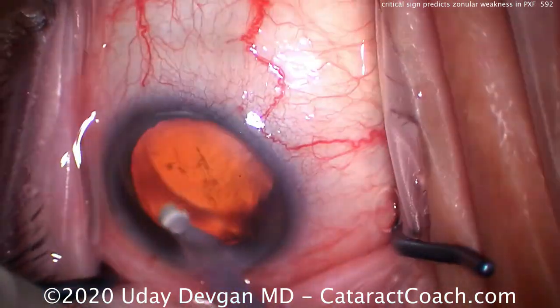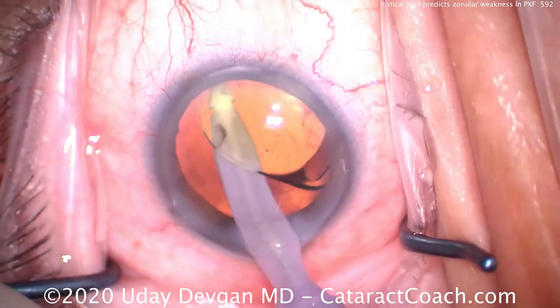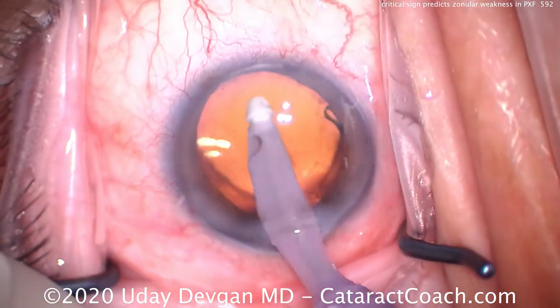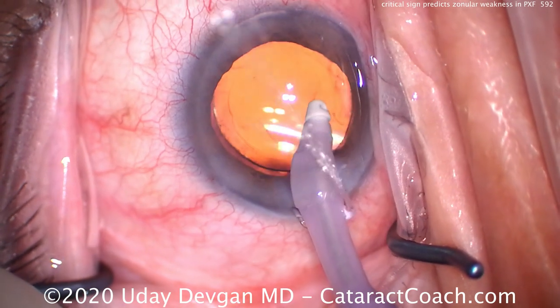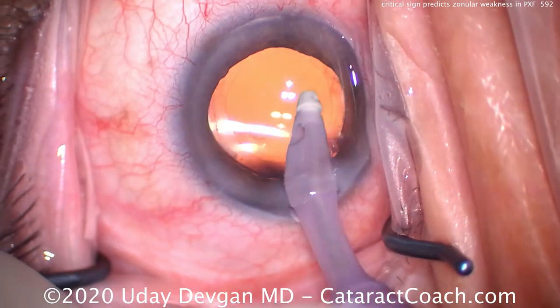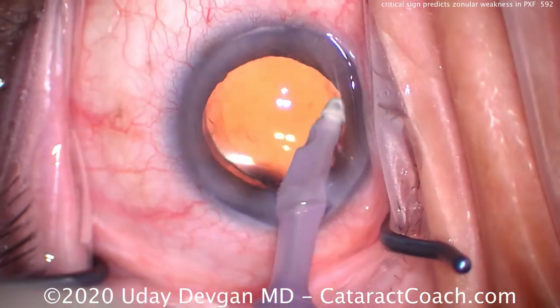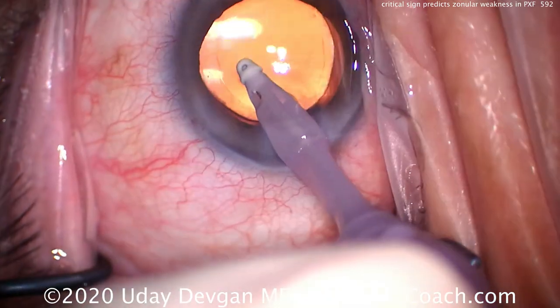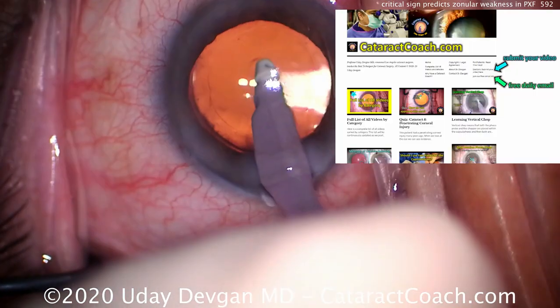Let's remove our viscoelastic and finish up the case. This is one of those cases where I've shown you the complete case from start to finish — there's a lot of learning in watching a complete case with all steps shown. Finishing up, taking out the viscoelastic, sealing up the incisions. So again, our two critical signs are poor dilation and a shallow anterior chamber in the presence of a normal or long axial length — those cases are going to have a lot more issues with zonular laxity.